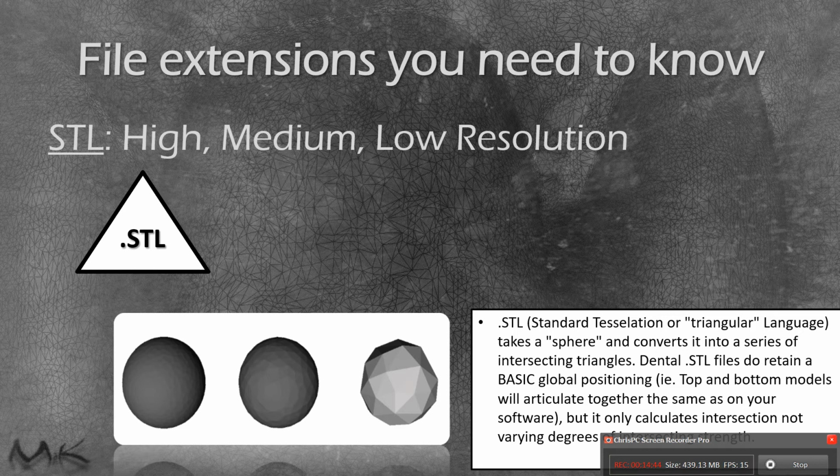If you're trying to fabricate a clear aligner for orthodontics and we're looking at 200 microns of accuracy as what we need for cross-arch stability, well then maybe that low resolution is a little bit easier file to give to your laboratory.